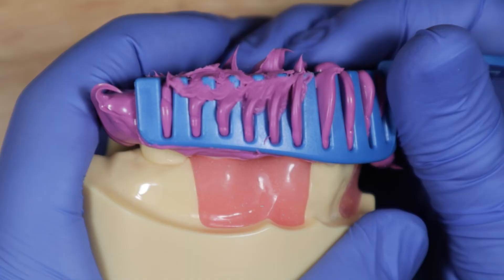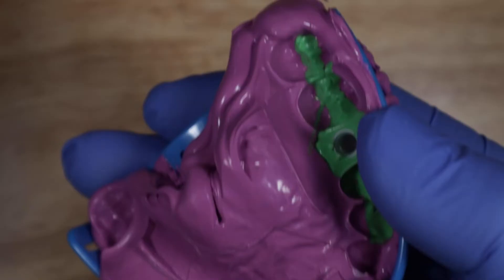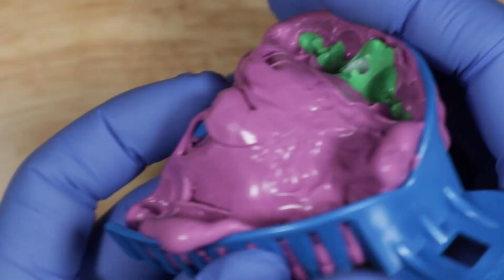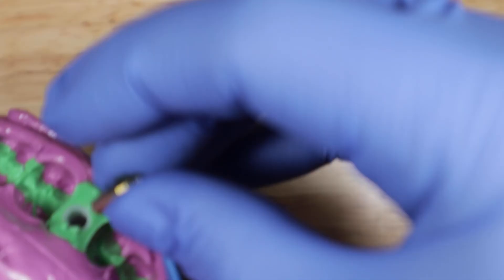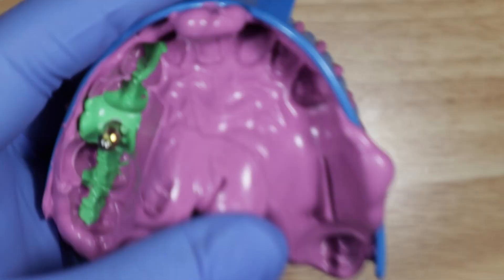Once the material has set, pull on three sides and it will pop off. It may be a little hard to remove, so pull on three sides first. The impression coping stays on the implant while the white cap stays encapsulated in the light body impression material — fully immobilized. Remove this, then send the impression along with the impression coping to your laboratory. They'll disinfect them, orient everything correctly, and make the restoration for you. That's really all there is to closed tray impression copings — it's just a matter of matching up the flat surfaces.